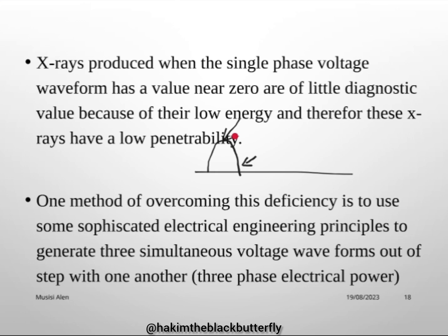So one method of overcoming this deficiency is to use some sophisticated electrical engineering principles to generate three simultaneous voltage waveforms that are out of phase or out of step with one another, which we call three-phase electrical power.